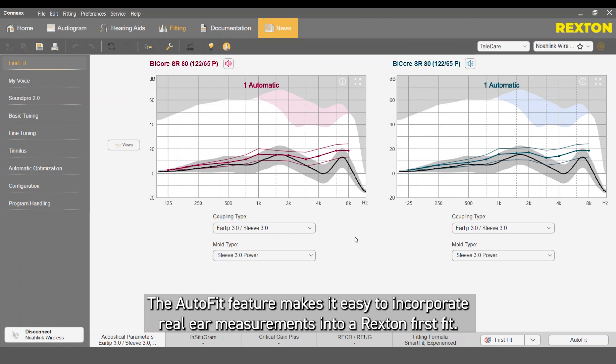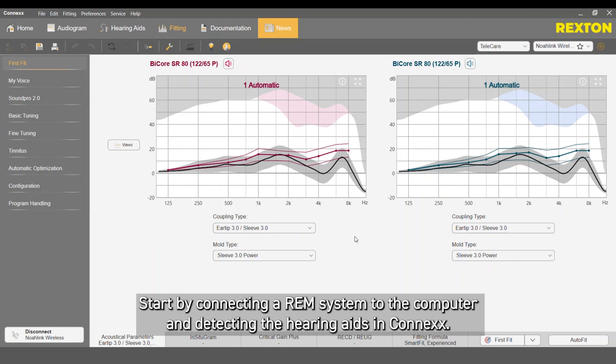The AutoFit feature makes it easy to incorporate real-ear measurements to a Rexxon FirstFit. Start by connecting an REM system to the computer and detecting the hearing aids in Connexx.